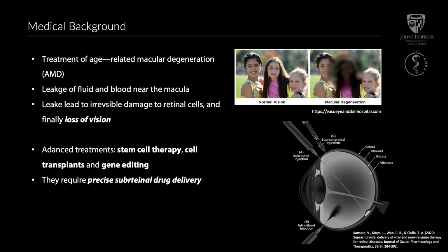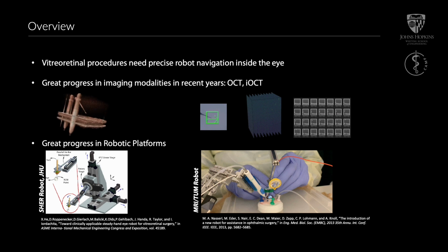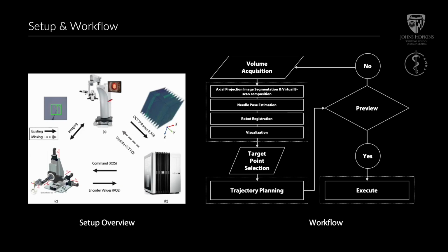in eye surgery. The field of microscopy has made significant strides with the introduction of optical coherence tomography (OCT) and intraoperative OCT, which offers real-time 3D OCT imaging. Similarly, there has been significant progress in the development of robotic systems for eye surgery, which can achieve micron-level precision. In this regard, we propose a system and a workflow which tackles the task of autonomous subretinal targeting.